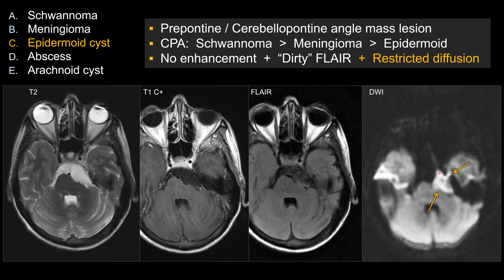In real life, epidermal cysts have the signature finding of restricted diffusion. If you see that, your differential diagnosis should be 100% epidermal cysts. But even without diffusion-weighted sequences shown, you should be able to identify the diagnosis based on the lack of suppression on FLAIR and other sequences, to pick the correct diagnosis at least among these five possibilities.